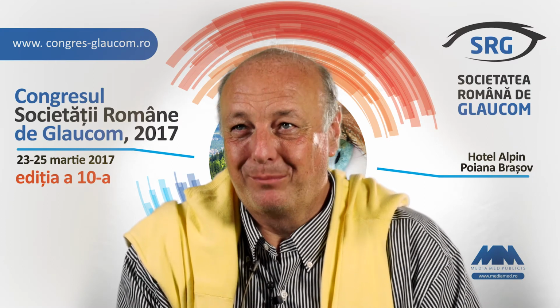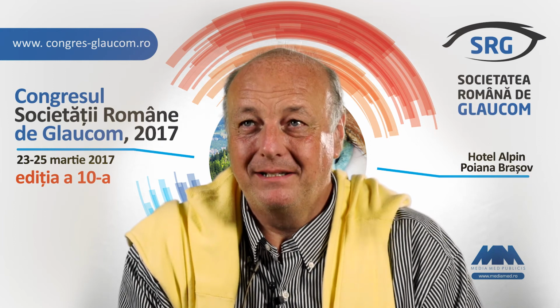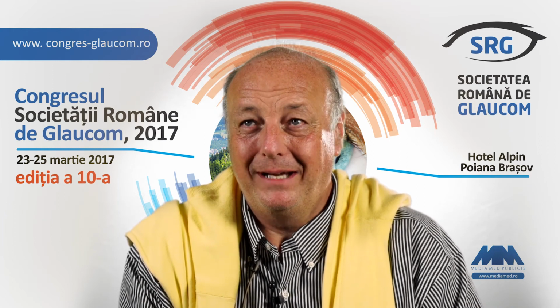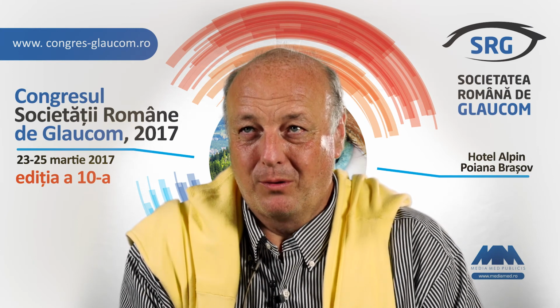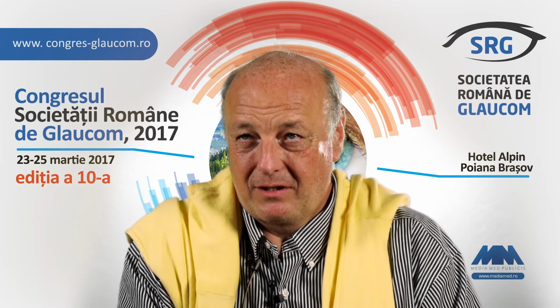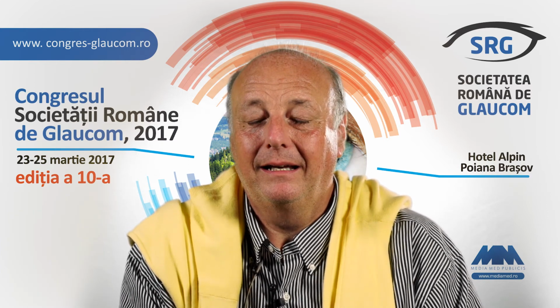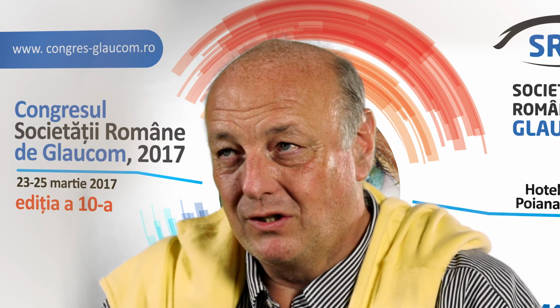Please perform gonioscopy, number 1. If you want to make the proper diagnosis of glaucoma, you cannot replace this examination with anything, so you have to make gonioscopy. You should make gonioscopy in both eyes. You should make it in a dark room. You should make it after tonometry measurement, and it takes maybe 2 or 3 minutes to perform it for each eye maximum.